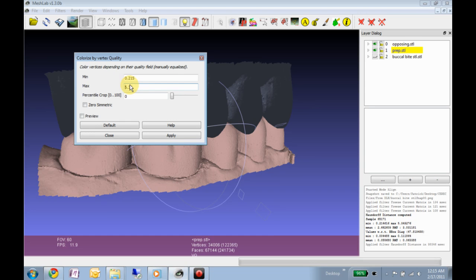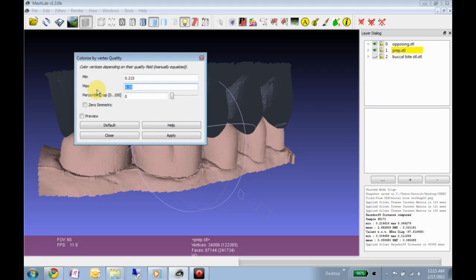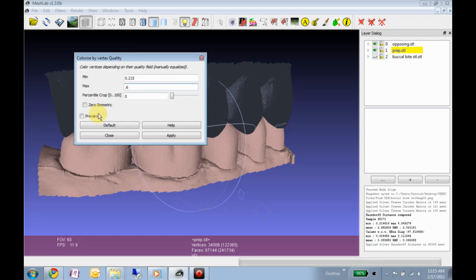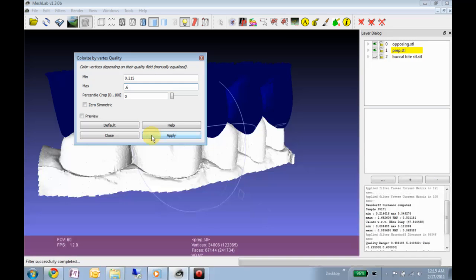But maybe if we can just say, okay, let's just do some error. Maybe 0.2 to 0.6 would correspond to what a real, you know, if they were touching, what the contacts would be. Apply that.